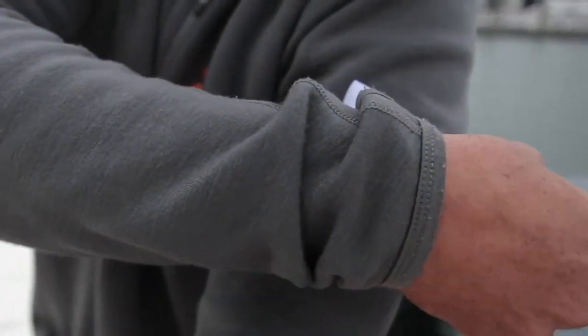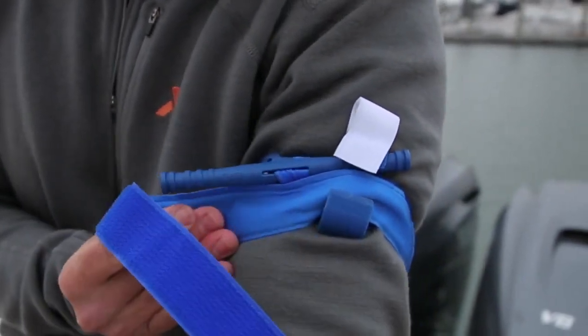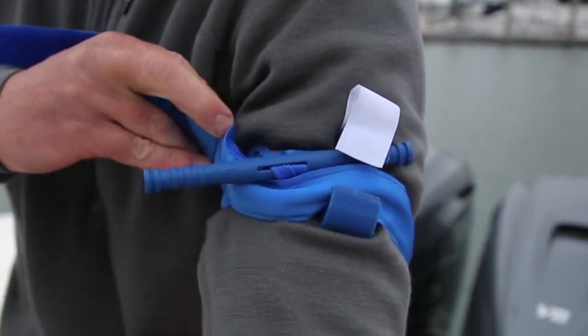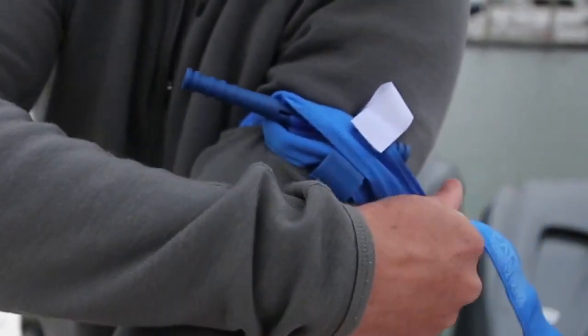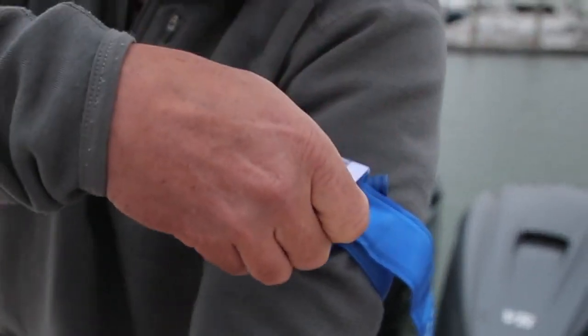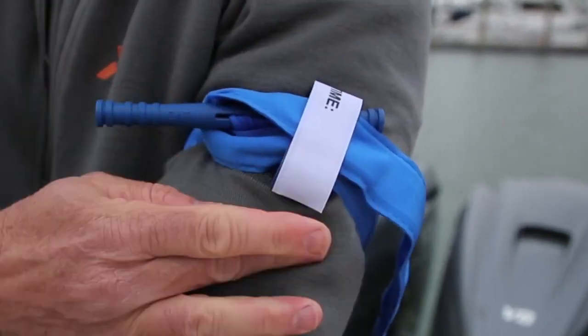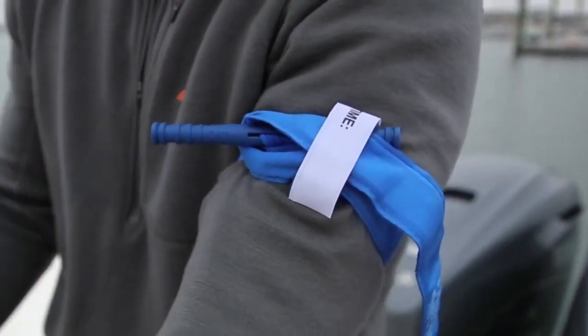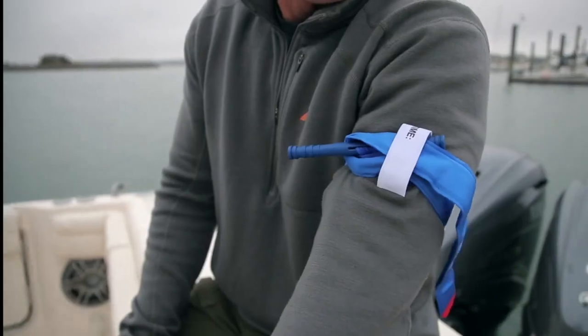Now take your leftover tail and pass it through the windlass retention clip. Go ahead and pass it back through around the windlass just to lock it more securely into place. Then take the time-stamp windlass retention strap and put it across. Your tourniquet is applied — it's that simple, it's not rocket science. It's super basic, but that buys you the time to get to help and stops the bleeding in your extremity.